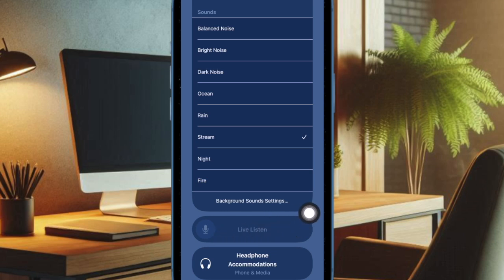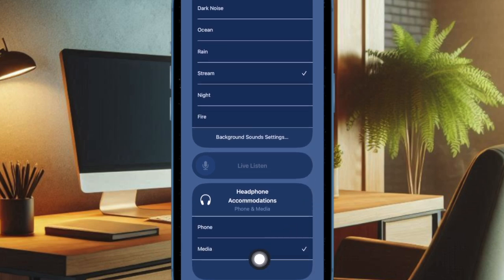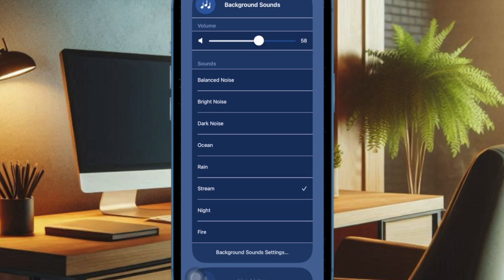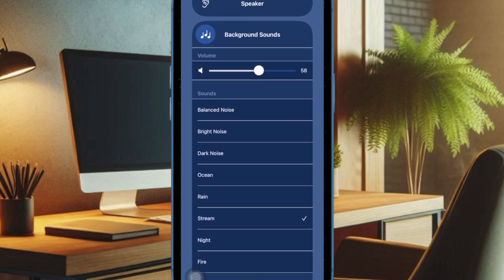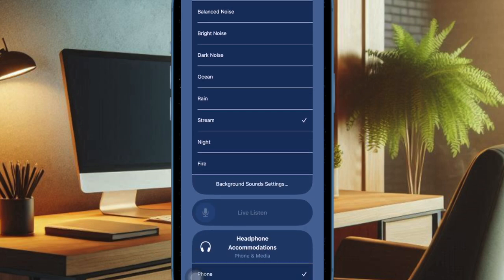By adding the hearing tool to your Control Center, you'll have quick access to features that enhance audio quality and accessibility, making your iPhone experience more personalized and fully functional.